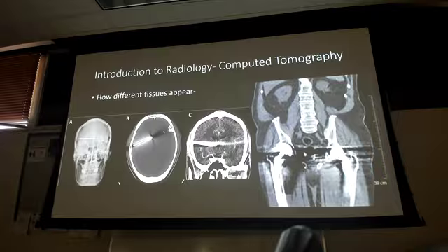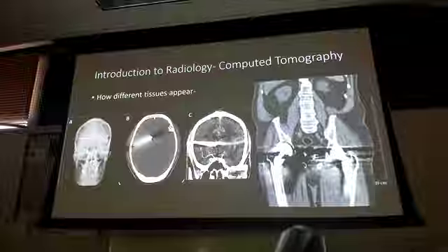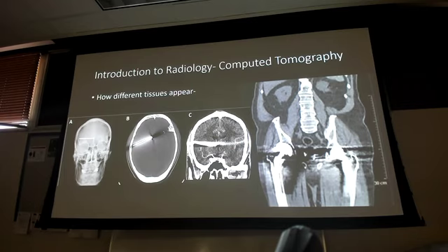What do we think this black is here by the nail head? Air, right? Cavitation, a couple of different things. So I like your thought process. This is one of those now. What it is, it's called artifact. Because the CT has so much radiation and it's super sensitive, some metal will create this artifact, this reflection, right? The sensor couldn't get any information off of this because the radiation kind of reflected around and it skewed some of the results. How do I know that?